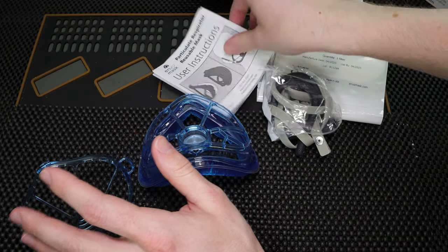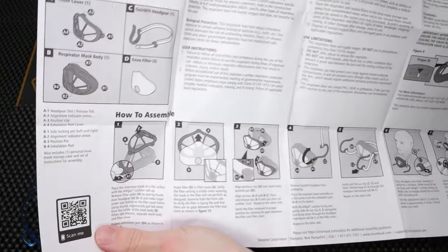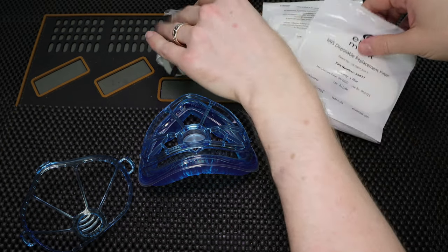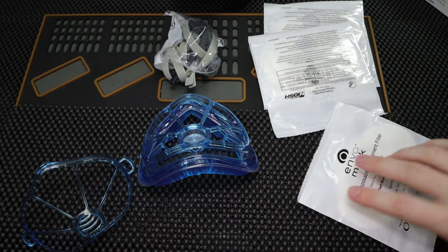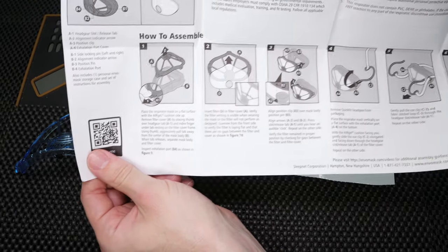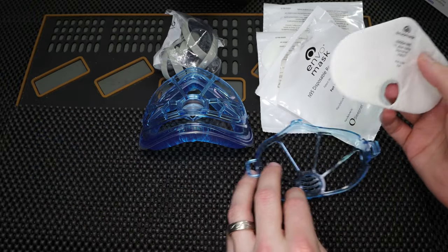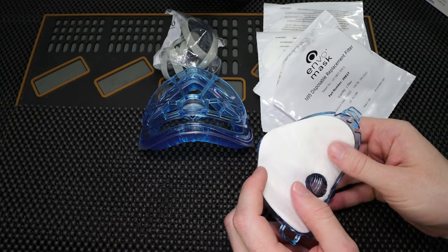When we open this up, we're going to see we have our instruction manual — it's always a good thing to read through just to make sure that you're doing everything correctly. What I'd like to do today is install one of these filters. I'm going to open this up and then we're going to place it inside the mask. It's always good to take a look at the instruction manual if you're not sure what to do. So the first thing I'm going to do — I've already opened up the individually wrapped filter — and then I'm going to take the front of my mask. You're going to see on the front here it's going to say 'this side facing out,' so we're going to place this right in here.